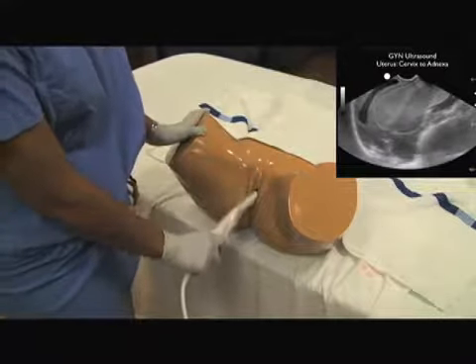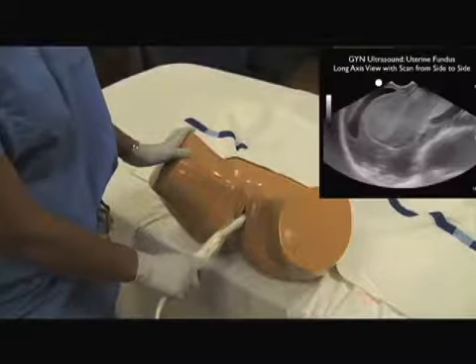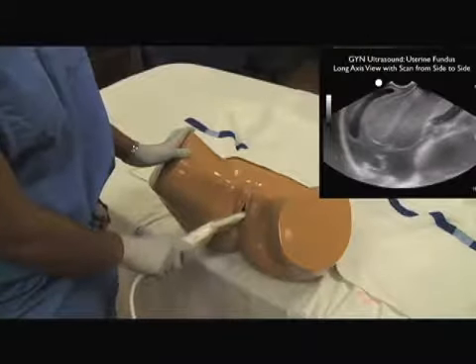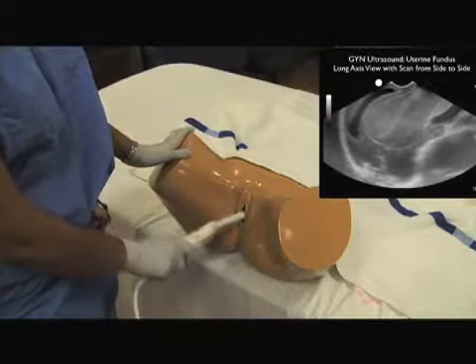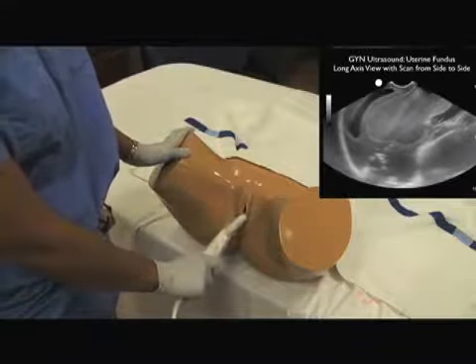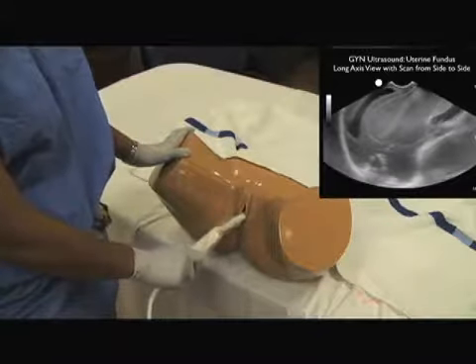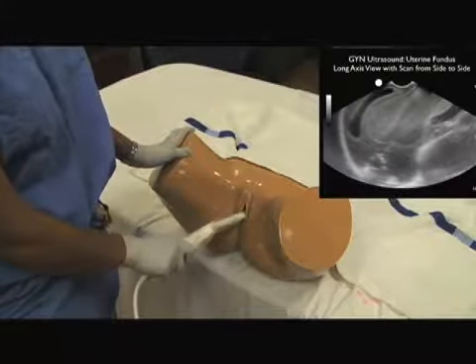To visualize the fundus, drop your hand, bringing the tip of the probe more anterior to visualize the fundus in most women. Once you've come into plane with the fundus, you'll need to slide from side to side to visualize best all the way through the endometrial stripe out to the outer margins of the uterus, to make sure to fully inspect the uterus for any signs of pathology or a small pregnancy.